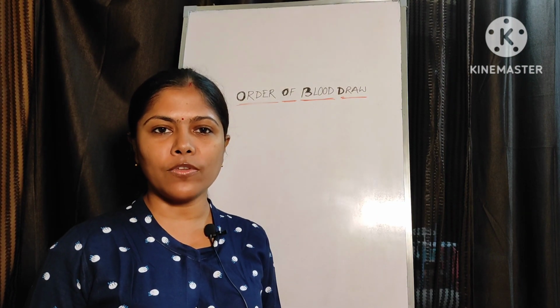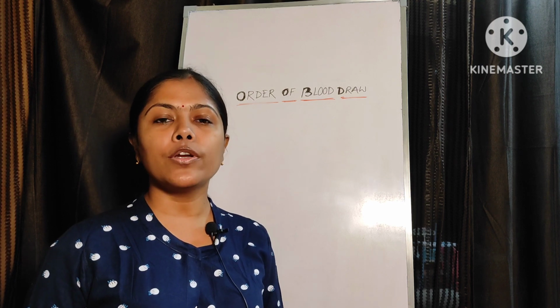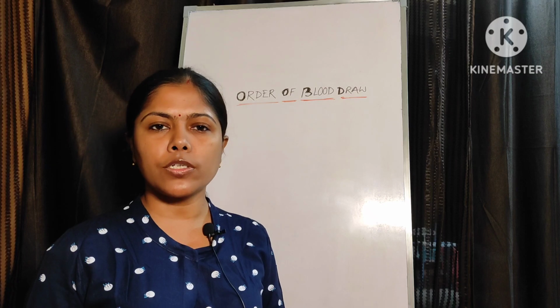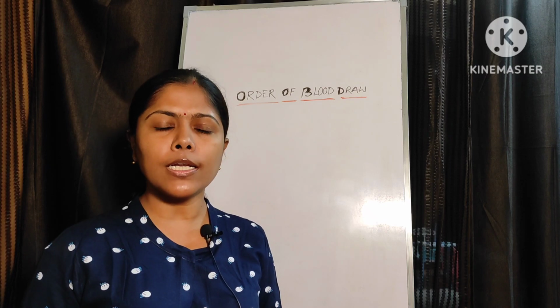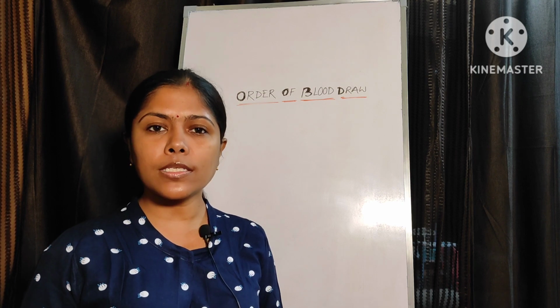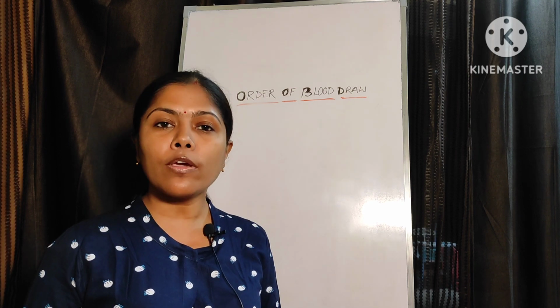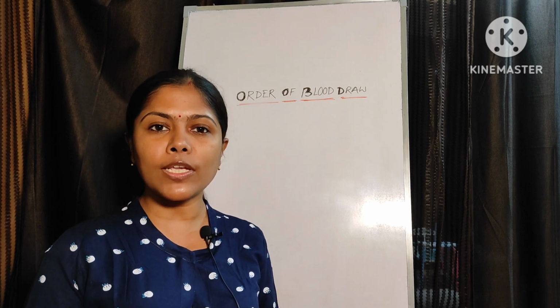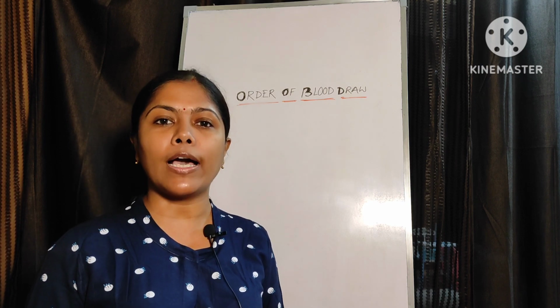I am back with a video on order of draw, or order of blood draw. Order of draw is a fundamental, rather vital step in phlebotomy. Now let us know what that is. To avoid cross contamination, it is the sequence in which blood should be collected in vials.